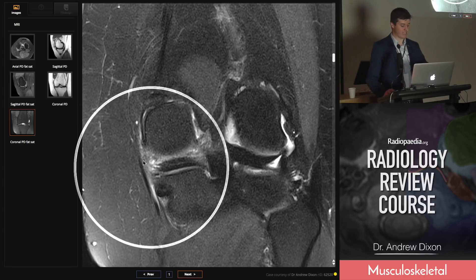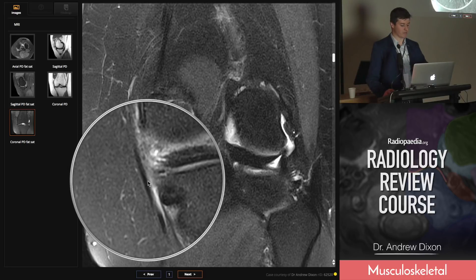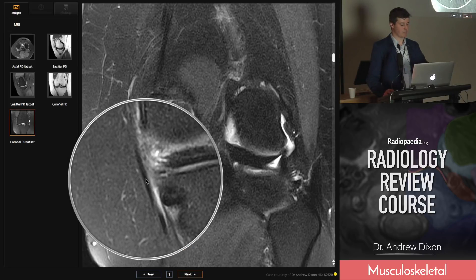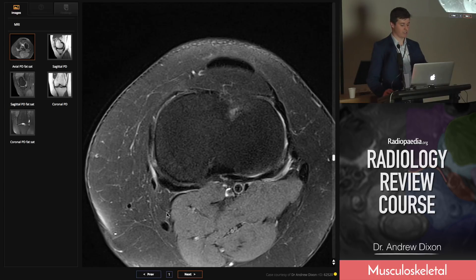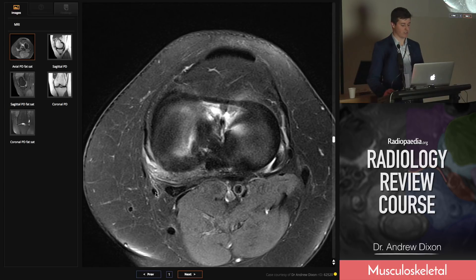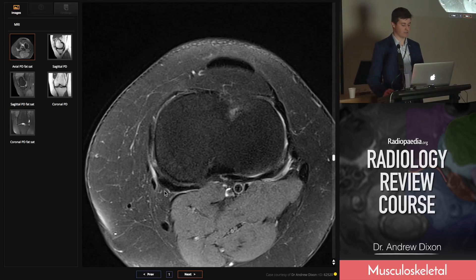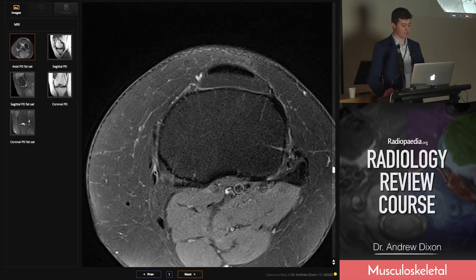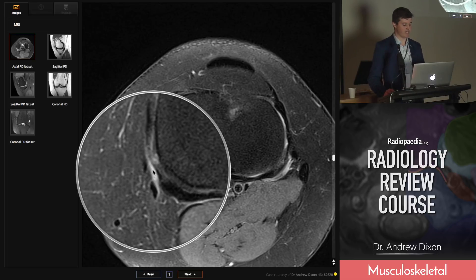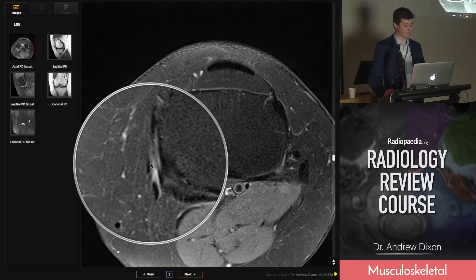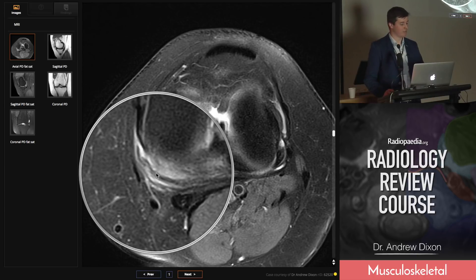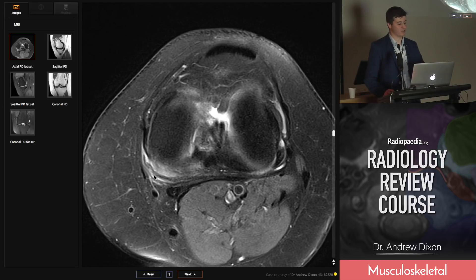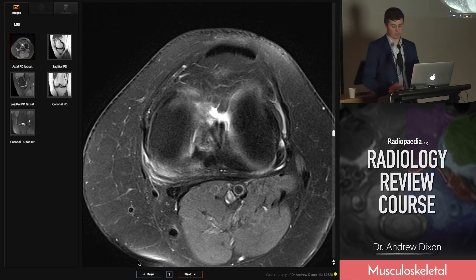In this case it's also causing pes anserine bursitis — you can see fluid sitting deep to those tendons. On the axial plane, here are the sartorius, gracilis, and semitendinosus, with fluid in the pes anserine bursa. That can be very painful when you get that synovitis and pes anserine bursitis related to a degenerative horizontal tear of the medial meniscus.